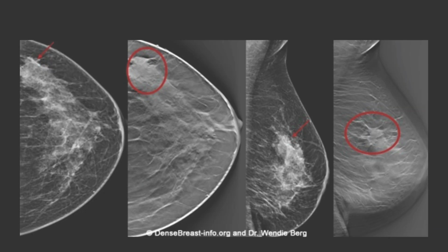And then this is just another example of a dense breast. The image on the left is a 2D image, and then moving to the right, that's a 3D or tomosynthesis image. A little easier to see, and I'm sorry I can't illustrate a video clip to show. Scrolling through it would be a little more obvious. And then again, moving to the right of that, we have the 2D and the 3D images in the other view, the MLO view.